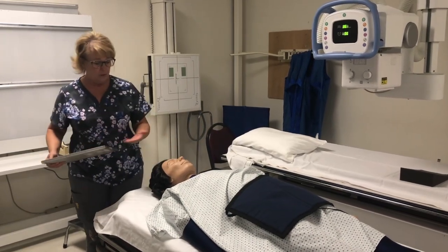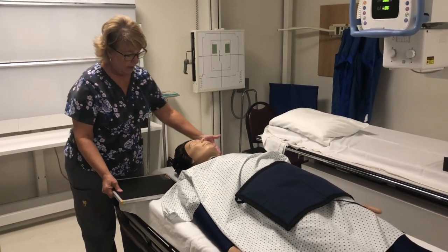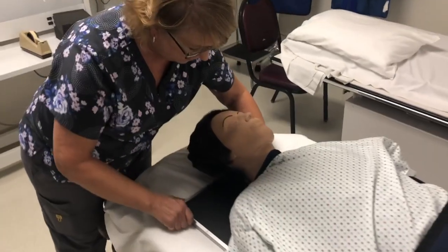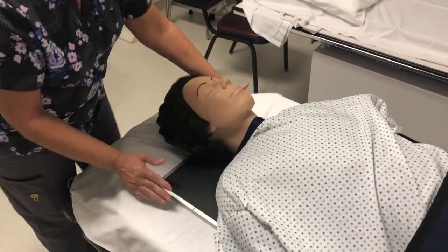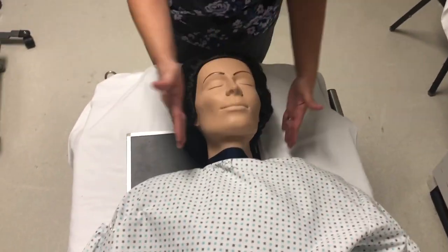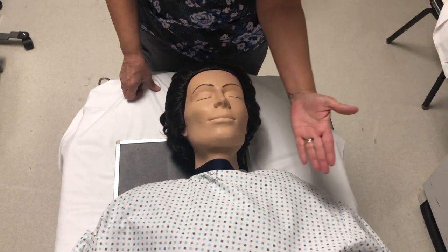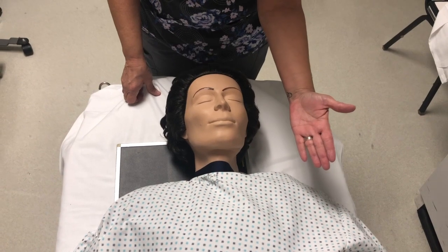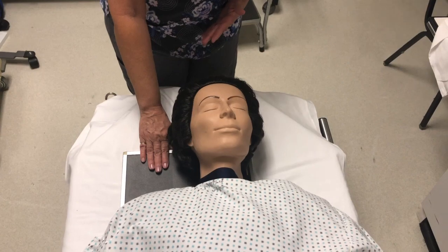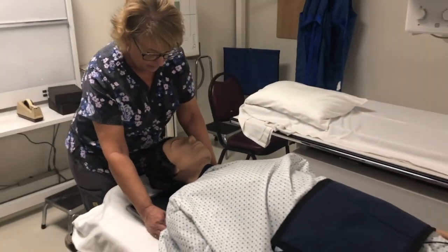So what you're going to do, the patient will most likely be on a slider board. So I would go under the slider board and I would take a 10 by 12 and you'll notice that I'm offset, okay? The patient is centered over half of the IR, but because I'm gonna come in at a 45 degree angle, it's gonna project the cervical spine over to the center of the IR. And so I'm centering pretty much like I normally would.